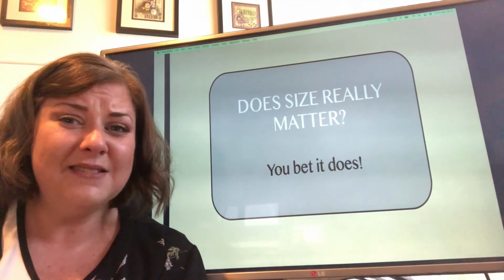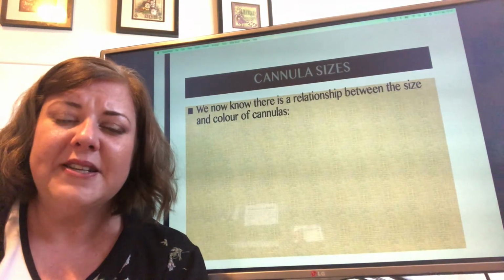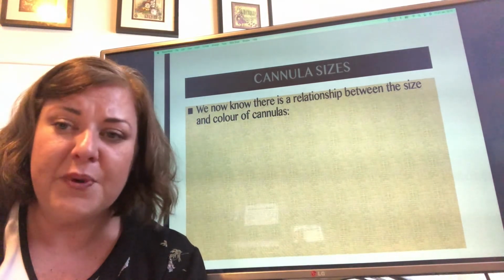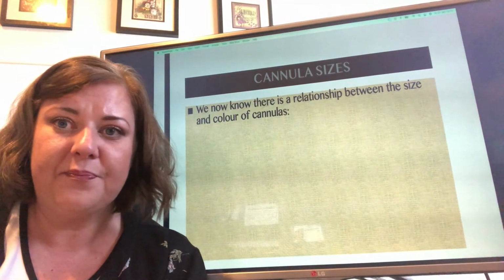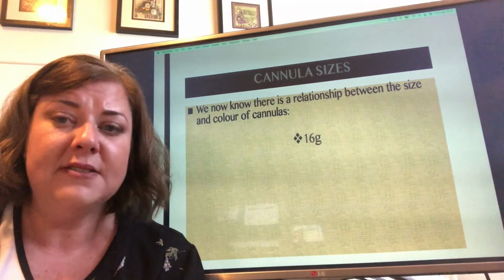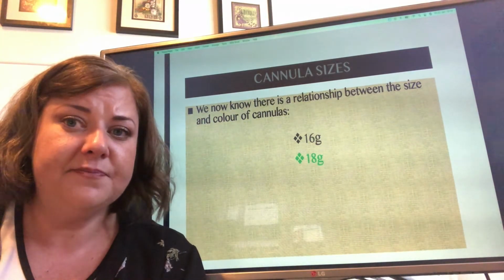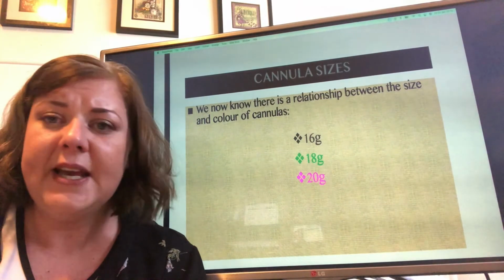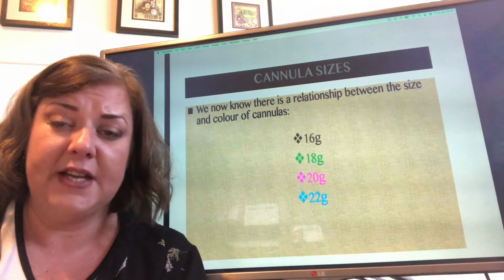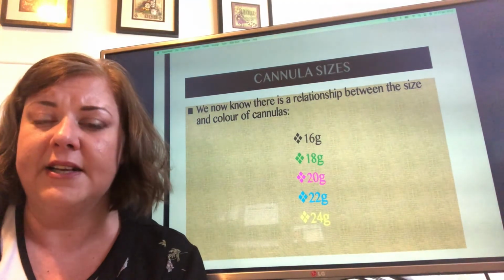And does size matter? You bet it does. So now we know that each cannula colour is a different size, we're going to talk about what they are. A 16 gauge cannula is grey. An 18 gauge cannula is green, a 20 gauge cannula is pink, a 22 gauge cannula is blue, and a 24 gauge cannula is yellow.